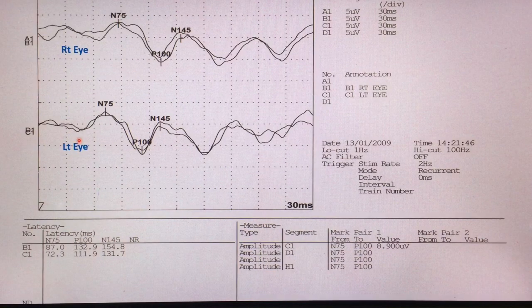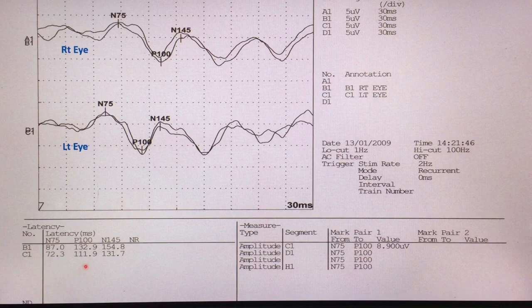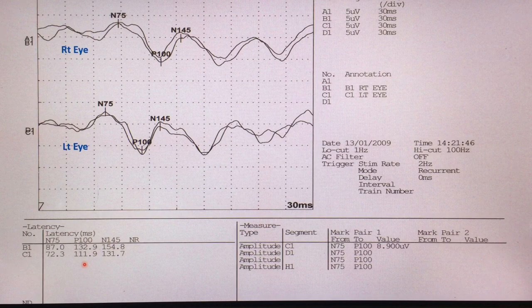Right side P100 latency is 132.9 milliseconds. Left side P100 latency is 111.9 milliseconds. The interpeak P100 latency difference is 21 milliseconds, with no asymmetry in amplitude.